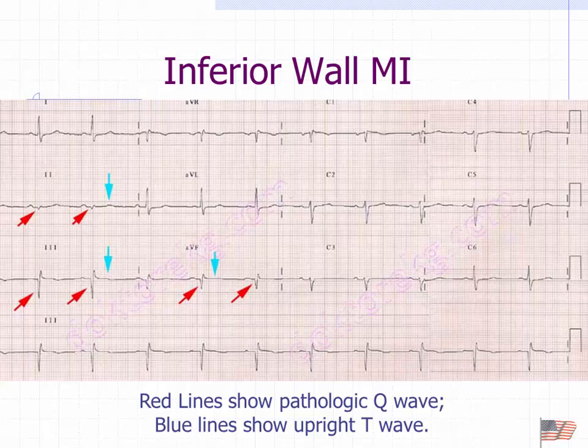That's the presence of a Q wave, right? Yep. First downward deflection after the PR segment. If it's in the third lead, that means it's inferior. 2, 3, and aVF all have prominent Q waves. Not as noticeable here, but definitely noticed there. So you know which coronary artery. What feeds the inferior wall? Partially the circumflex, mainly the right coronary artery.